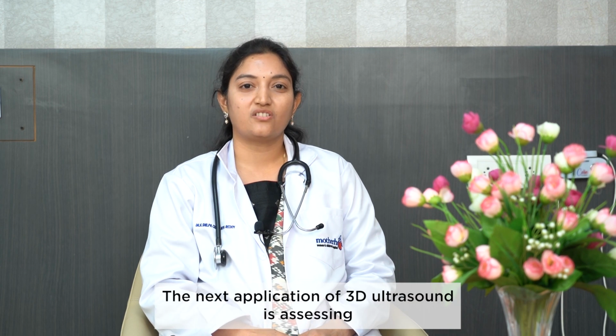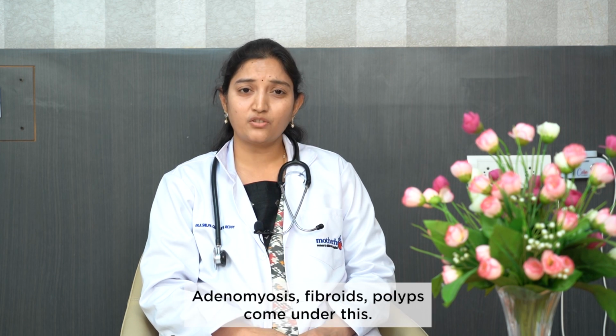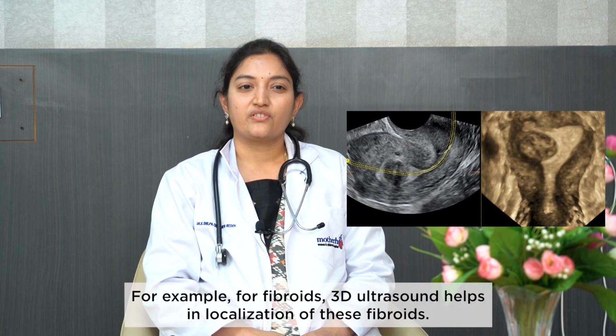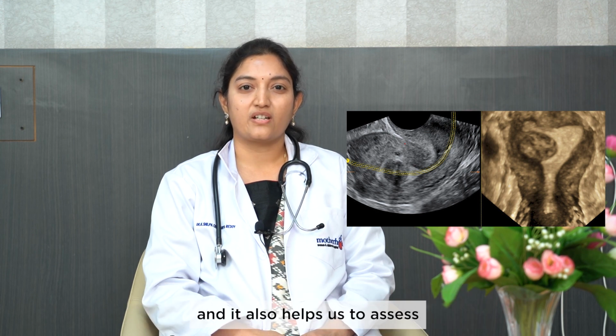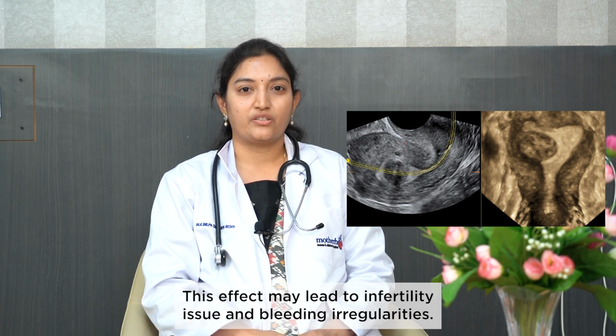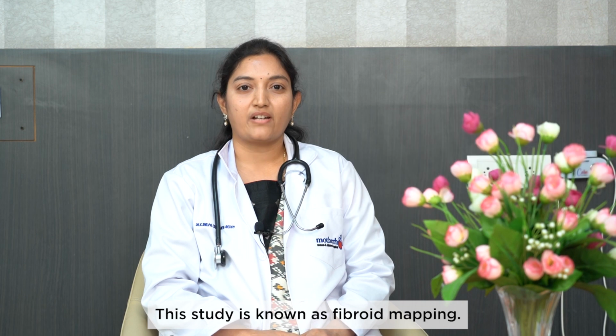The next application of 3D ultrasound is assessing the acquired uterine endometrial and myometrial pathologies. Adenomyosis, fibroids, polyps and synechia come under this entity. For example, fibroids. 3D ultrasound helps in localization of these fibroids, and it also helps us to assess if the fibroids are causing any pressure effect on the uterine cavity. This effect may lead to infertility issues and bleeding irregularities. 3D ultrasound helps us to localize these lesions. This study is known as fibroid mapping.